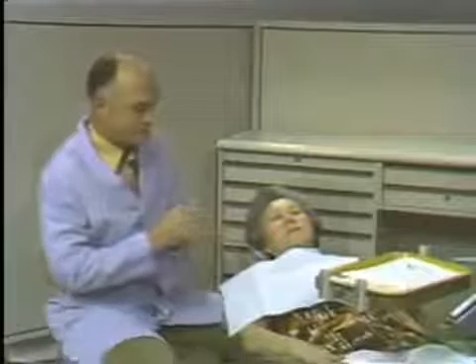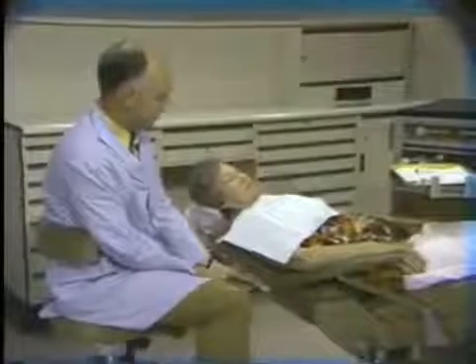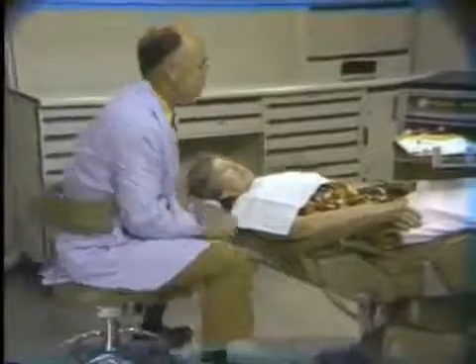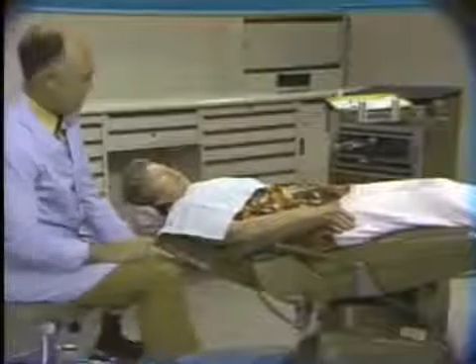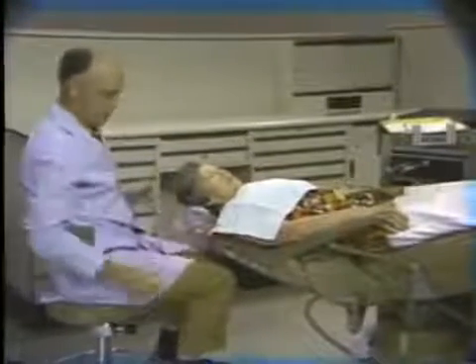Now if we continue in the maxillary arch, the seat will be dropped to about plus 10 degrees. And the chair must be raised so that the operator can have his knees under the back. You'll notice that I have lowered the operator's stool so that the thighs are more parallel to the floor. Now the operator moves in at the 11 or 12 o'clock position, and we're ready to look at the maxillary arch.